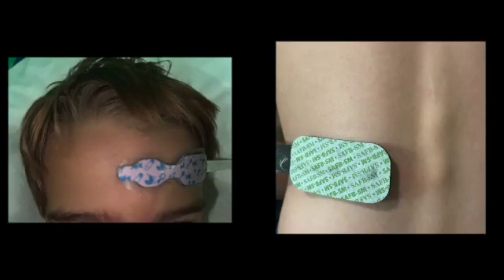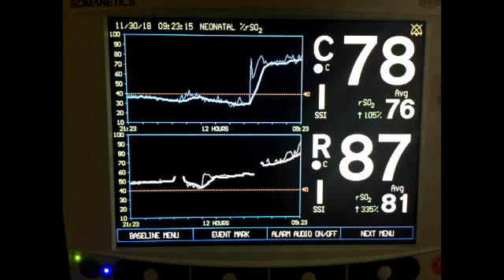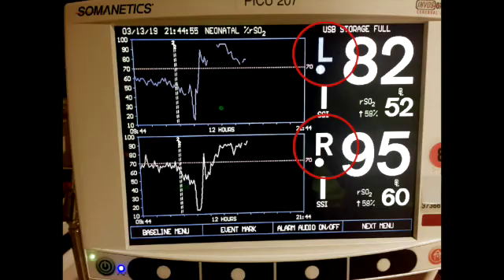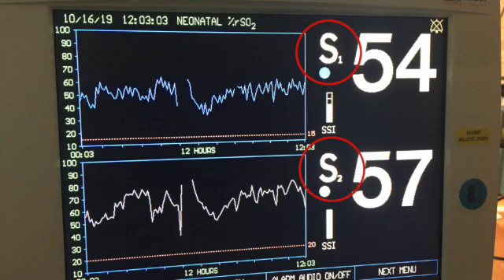NIRS probes can be placed anywhere on the body, but the most common locations in the pediatric cardiac ICU are the forehead and the back. Let's look at this box. By convention, the top number is the forehead probe — C for cerebral — and the bottom number is the back probe — R for renal. There can be other labels, so just remember the top is the head.